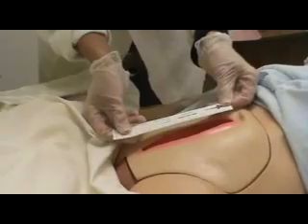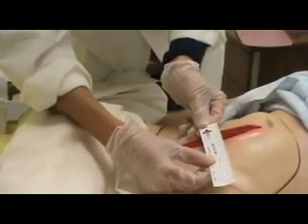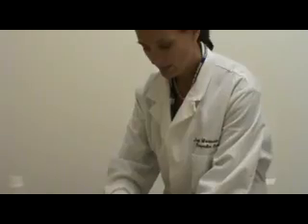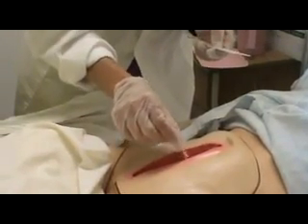Take my measuring tape. Okay. And ever so carefully, without touching the wound, I'm going to eyeball it. That looks like 14 centimeters long by 2.5 centimeters wide. And now I take my cotton tip applicator and put it in the wound ever so gently. I'm not going to jam it down. Then I go to the top part of the wound and measure the depth. That looks like about 2.5 centimeters deep.